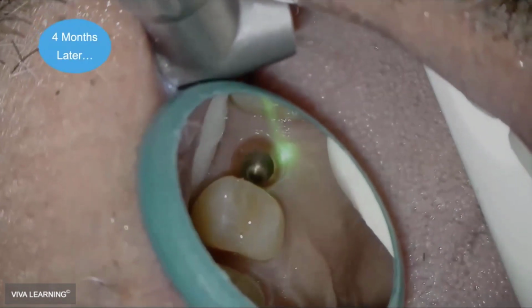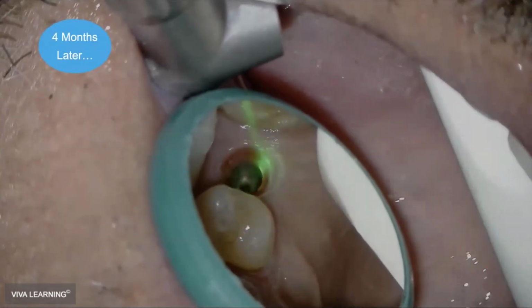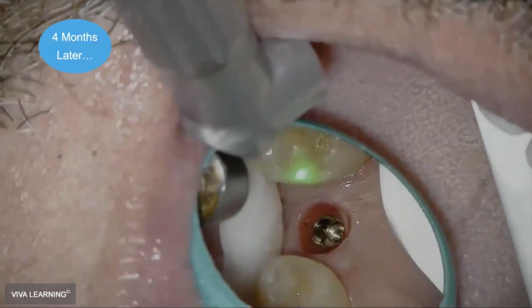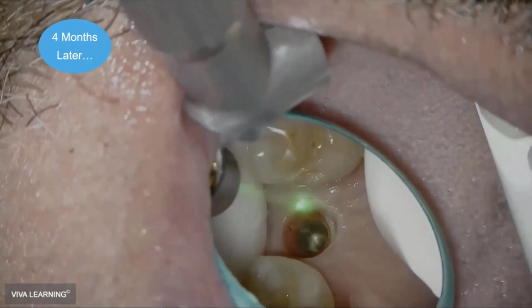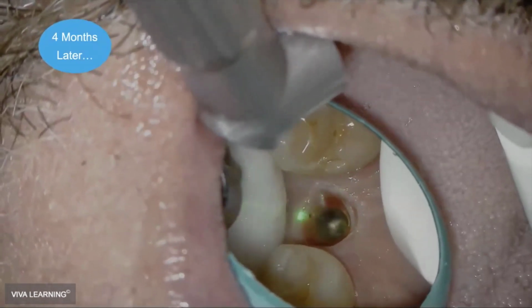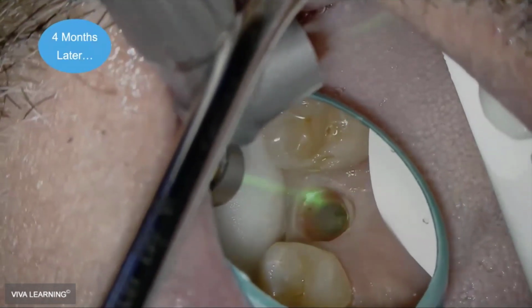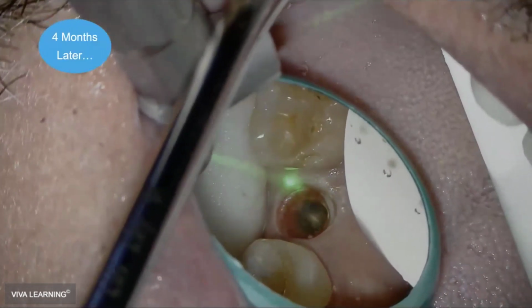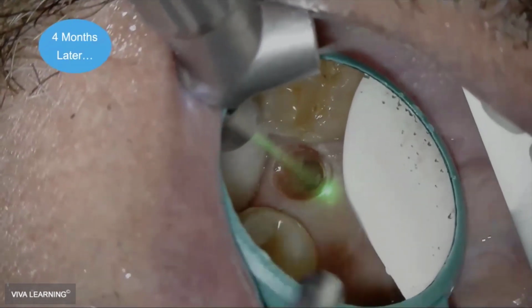This can be as fast as you want it to be, or it can be as slow as you want it to be. It all has to do with control. I like to tell people that when you're using a laser like this, it's like driving a car. What I think might be comfortable, speed limit wise, going around a curve might be different than what you think is comfortable. I might drive 50 miles an hour around a curve. You might drive 60, and that's okay. We still get to the same place. You just do it the most comfortable way possible.